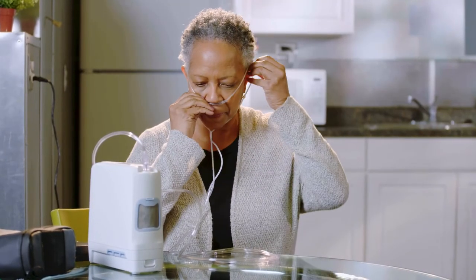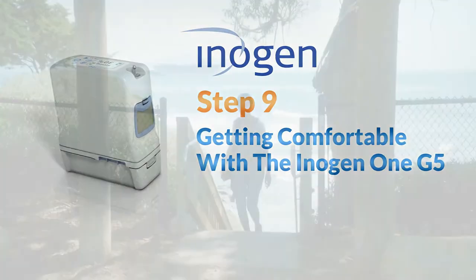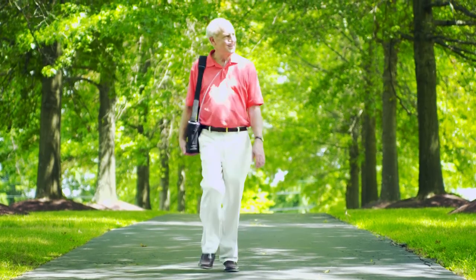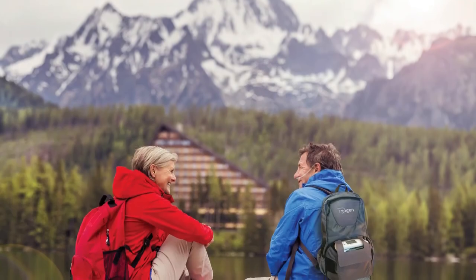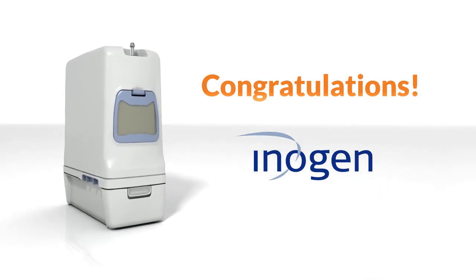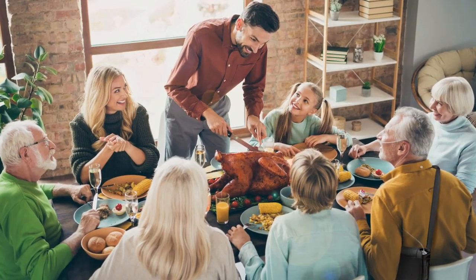Now position the nasal cannula on your face and breathe normally through your nose. Oxygen will only be delivered while you are breathing through the nasal cannula connected to the device. Every oxygen therapy product is different — give the Inogen 1 G5 some time to get used to. It may be a different pulsing sensation at first than what you're used to. Have the confidence to know that Inogen has thousands of other users enjoying the product around the country. Congratulations — you're set up and on your way to reclaiming your freedom and independence with Inogen.